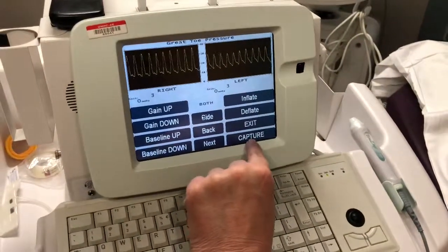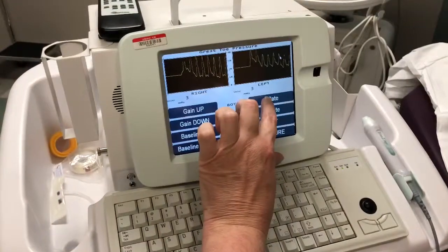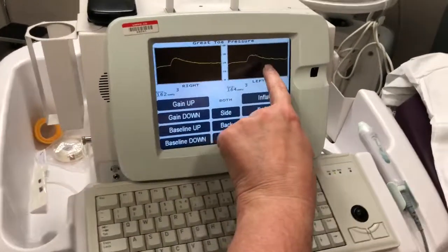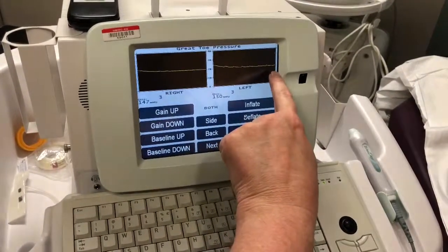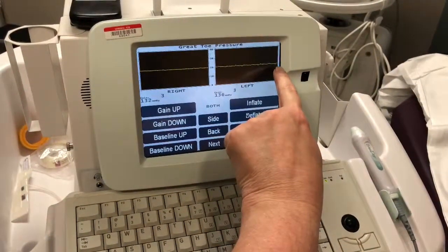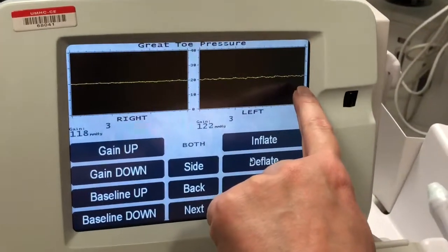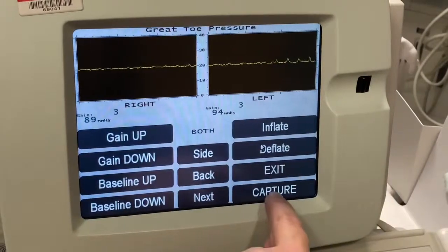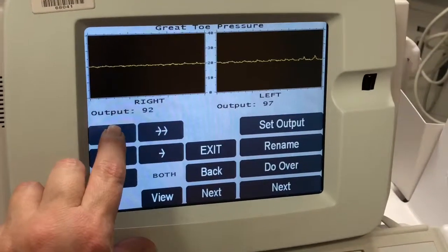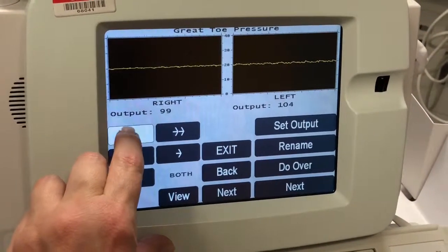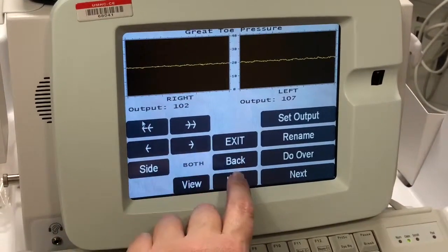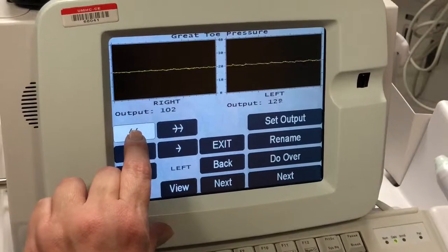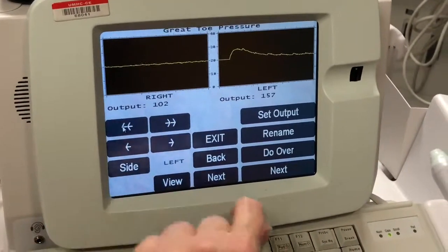We will now get the pressures, then deflate. Watch for where the pulse comes back — you can already see it's coming back on the left. There might be some noise from the machine as well. Here's the waveform coming back — it's a little different than what it was. Hit capture and go back to where it began for the right, then select the left by hitting 'side,' and go back further on the left toe, then hit next.